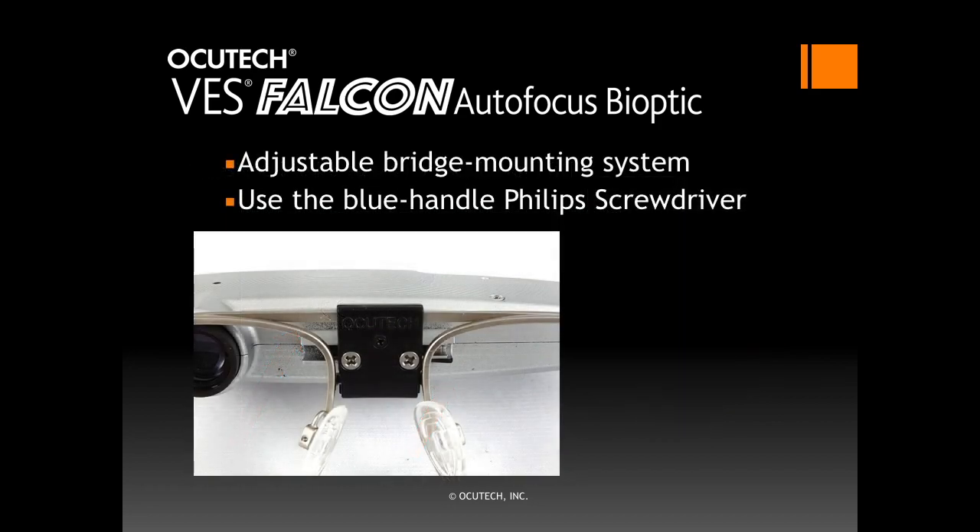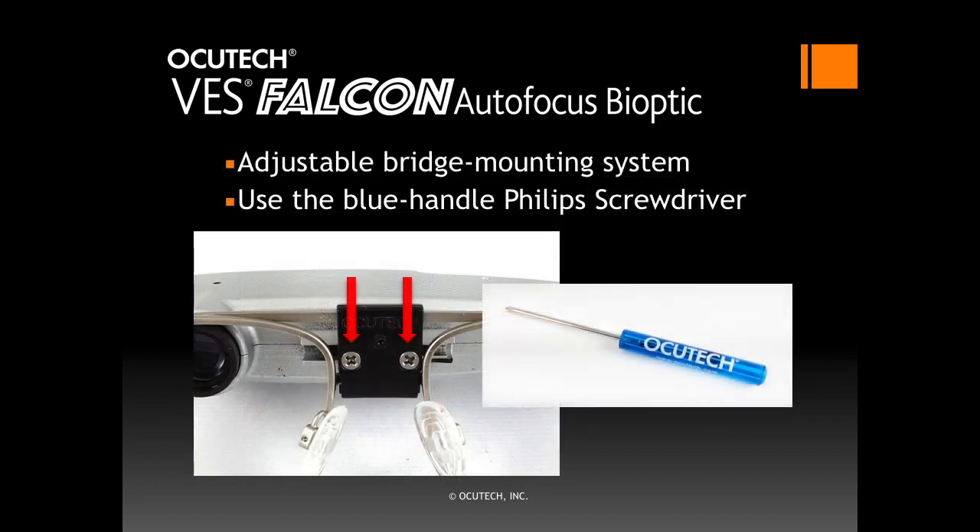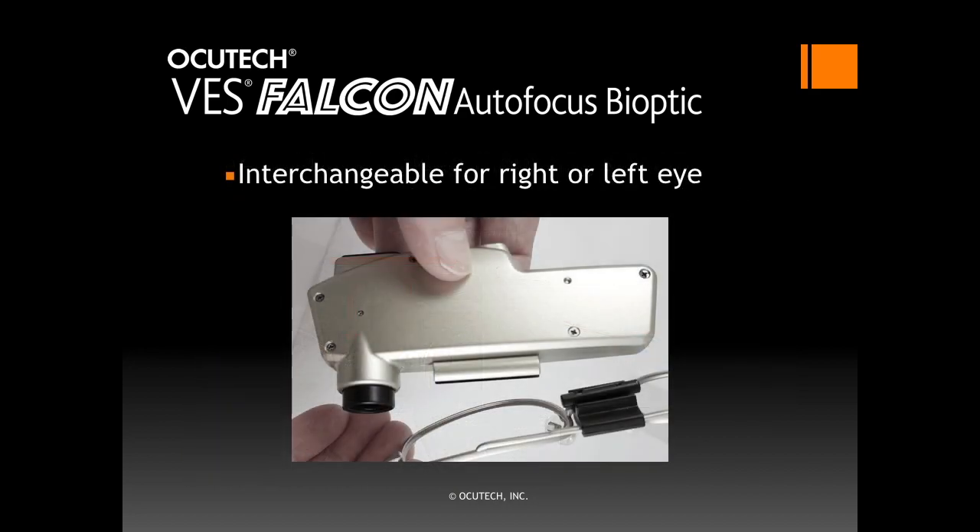The Falcon is attached to the frame using the bridge mounting assembly. By loosening the two silver bridge screws on the back of the frame with the Phillips screwdriver, the telescope can be moved easily right and left to position the eyepiece for the sighting eye. There is no need to remove the screws completely. To switch the Falcon to be used by the other eye, loosen the bridge screws a little bit more and the Falcon can be easily slipped off the mounting rod and slipped over for the other eye. Then simply slide the Falcon back onto the mounting rod and re-tighten the bridge screws just a little so that the Falcon stays in position when moved.